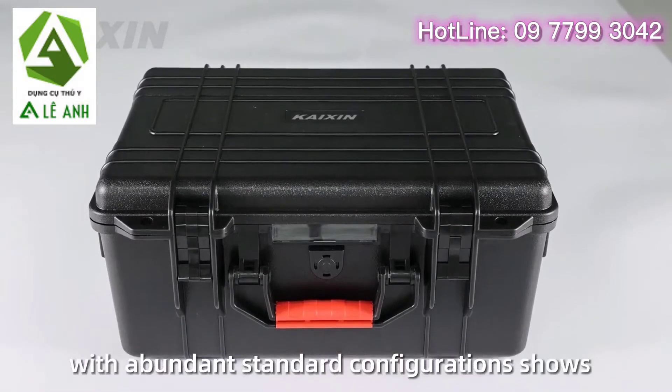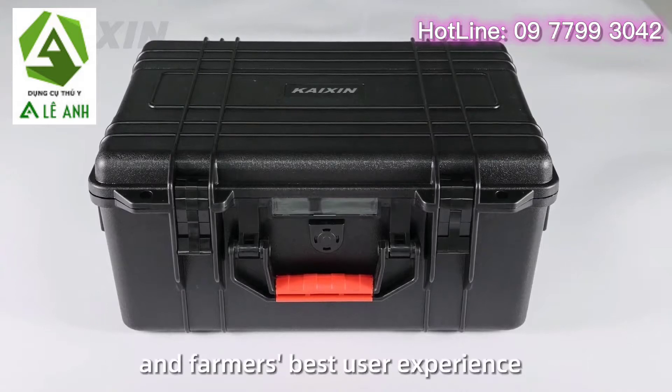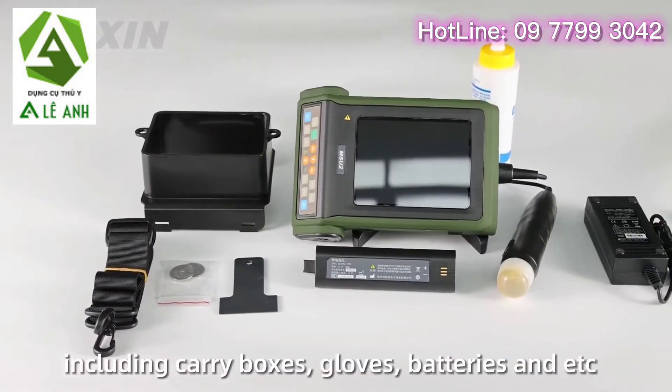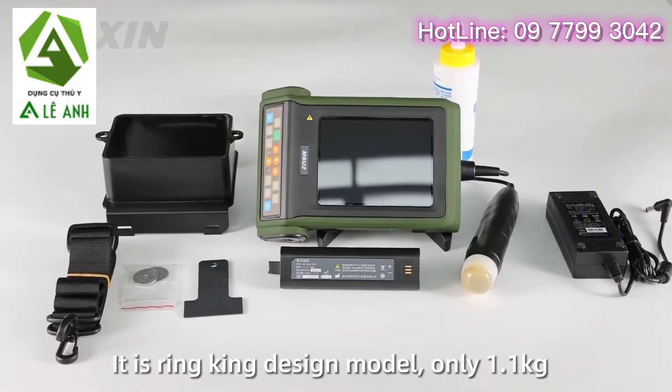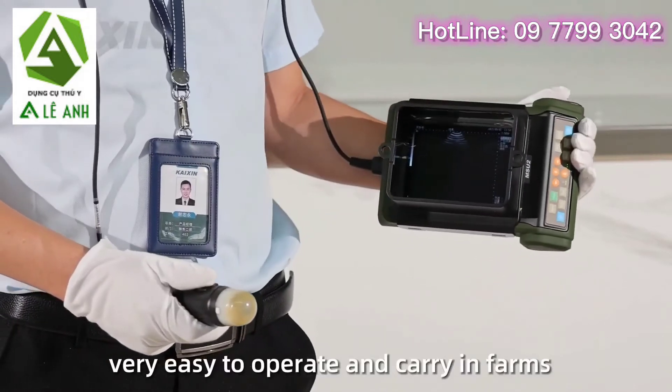The MSU2, with abundant standard configurations, shows veterinarians and farmers the best user experience, including carry boxes, gloves, batteries, and more. It is a ranking design model, only 1.1 kilograms, very easy to operate and carry on farms.